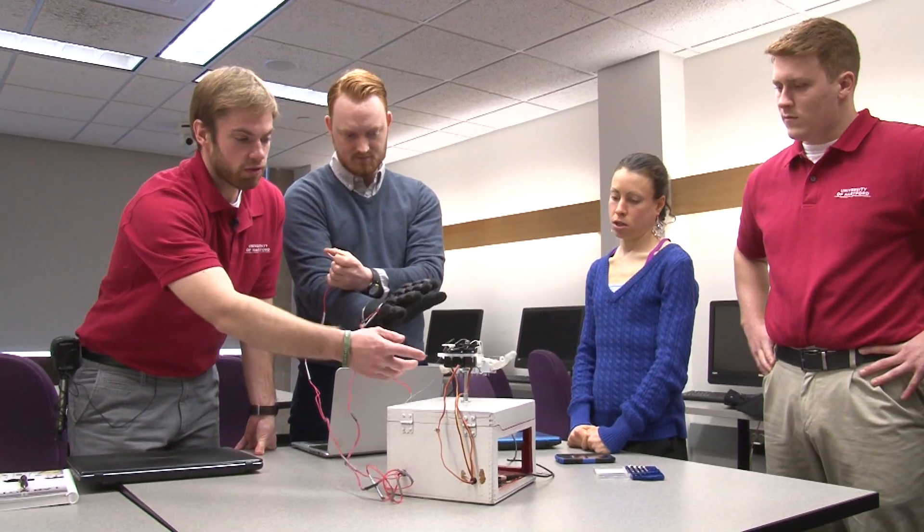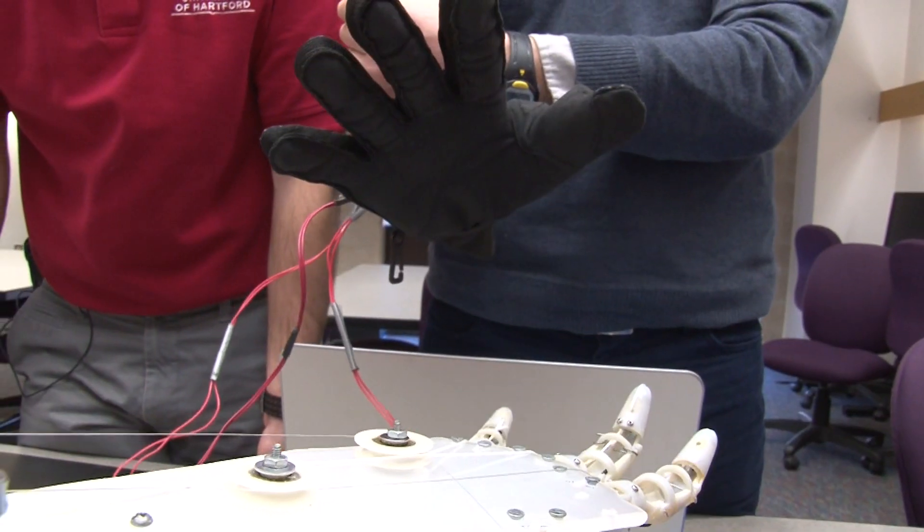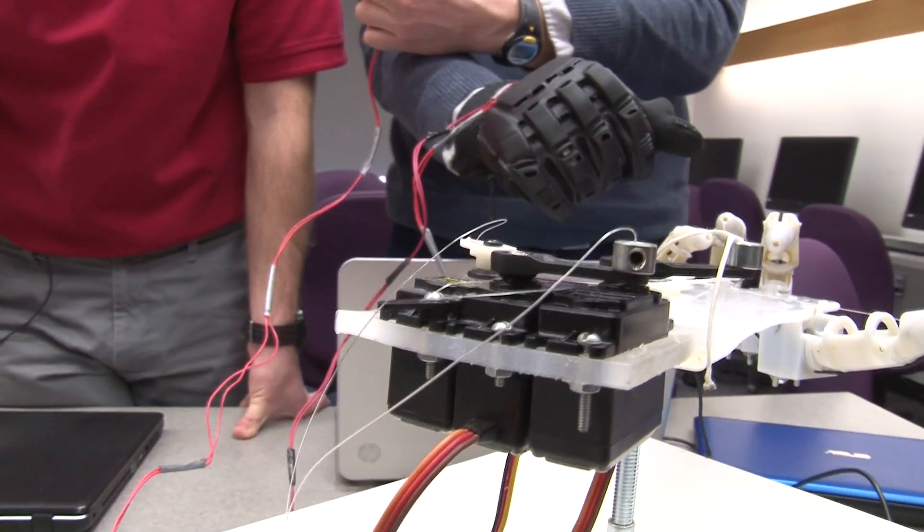The prosthetics and orthotics students get a chance to train on cutting-edge technology for an entire year before they go into the residency program. They will be able to say that they've had more training on upper limb prostheses than any other student in the country, which makes them competitive for their residencies — the next step after you graduate.